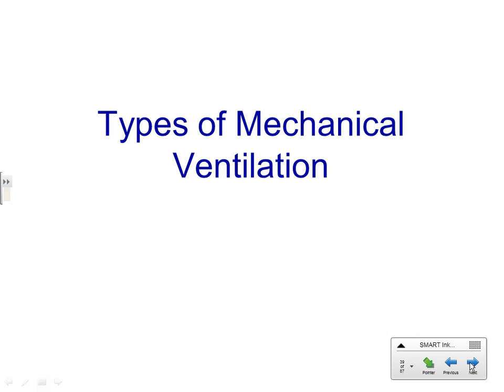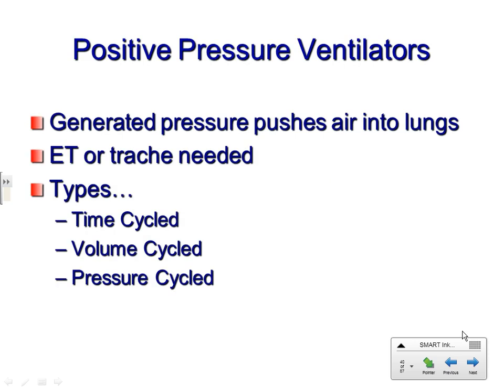And on your slide it says negative and positive pressure. We don't even talk about negative pressure ventilators, so you can cross that off your slide. I was told by Respiratory that they don't do iron lungs anymore or anything remotely like that, so we're not going to talk about those. But what we are going to talk about are positive pressure ventilators.